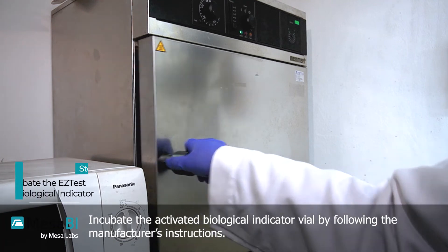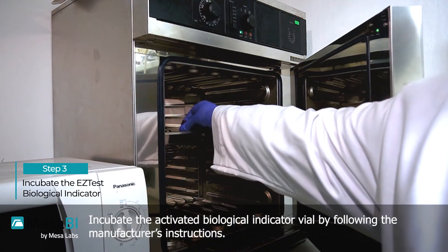Incubate the activated biological indicator vial by following the manufacturer's instructions.